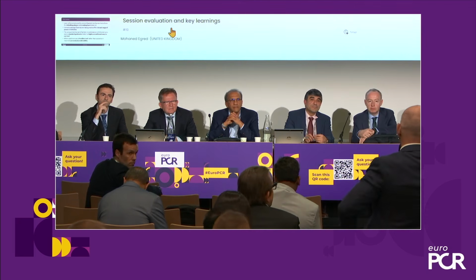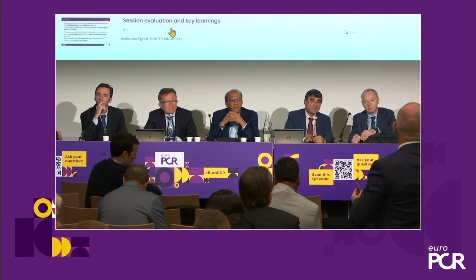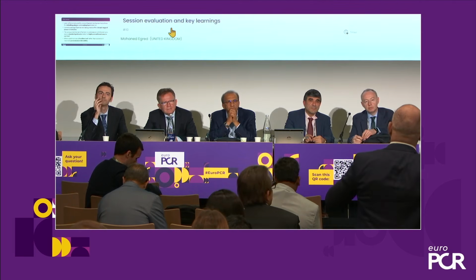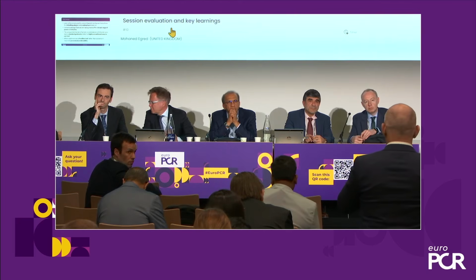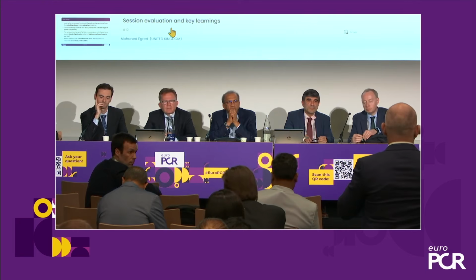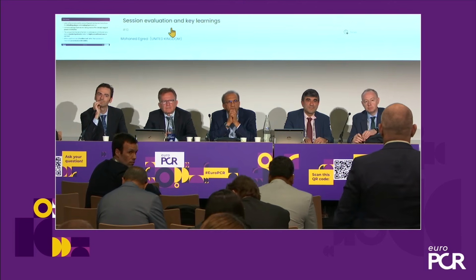From our experience in our center, we performed it also in the subintimal space, but we should be sure that the subintimal course is not so long, because of the risk of perforation. And as you say, in the subintimal space we never perform it with contrast, just without any infusion, to avoid the extension of the dissection in the downstream of the vessel. And that was always successful.